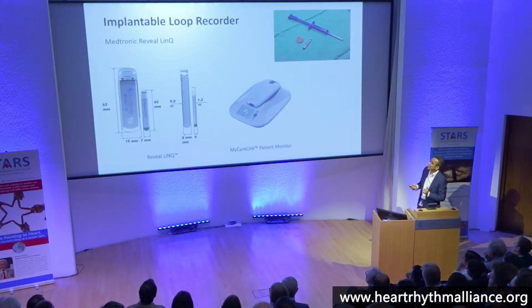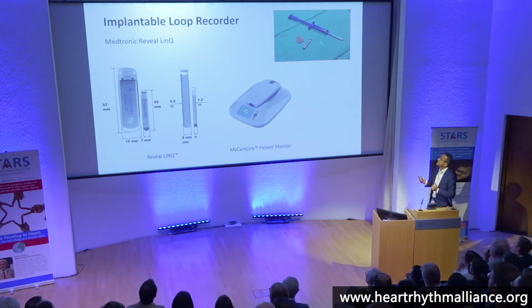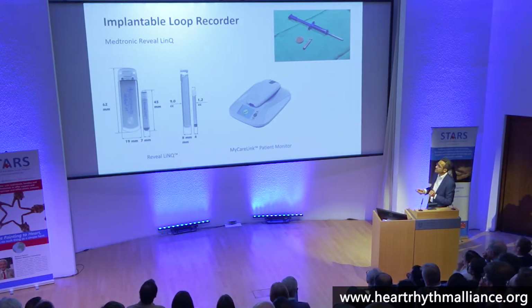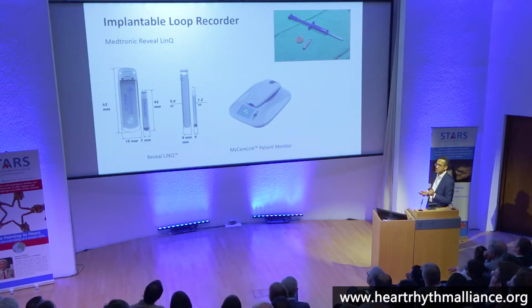But by far the gold standard has been the implantable loop recorder. This is a representation of size, not cost. And this has been in the market for many years now. This is the first iteration, the Reveal XT. It is much smaller now. The larger device is still supported, but the smaller device is probably much more in use now. I haven't implanted a large device for quite some time. It is very well received by patients.